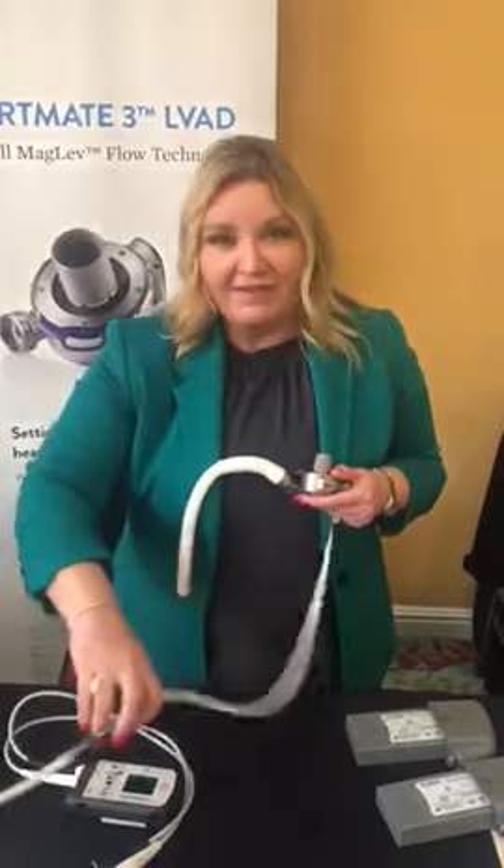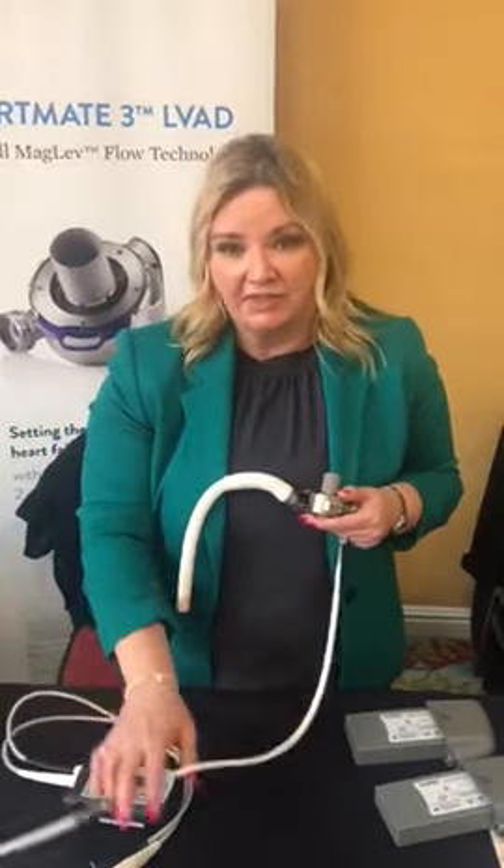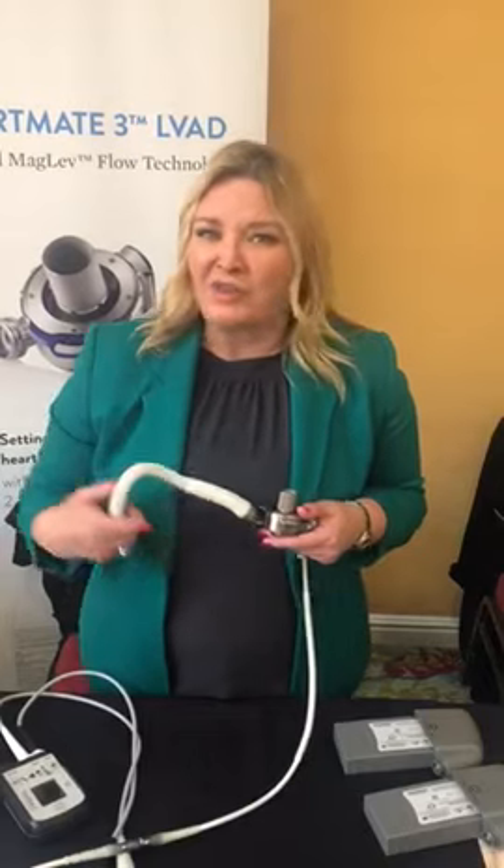Everything is completely implantable above the diaphragm, and then they'll have a cable that exits and hooks up to a little controller that's battery-operated. So again, it just gives patients an option while they're waiting for transplant or for destination therapy.